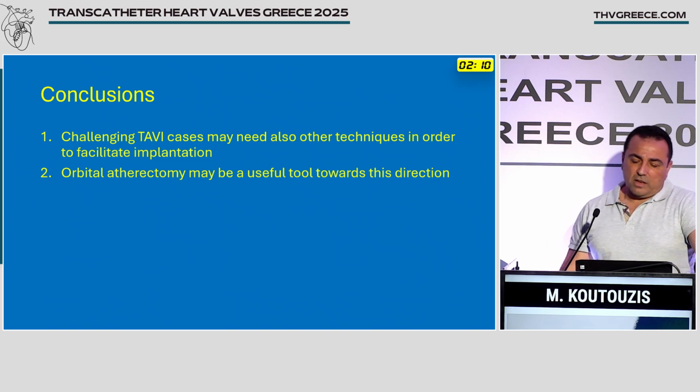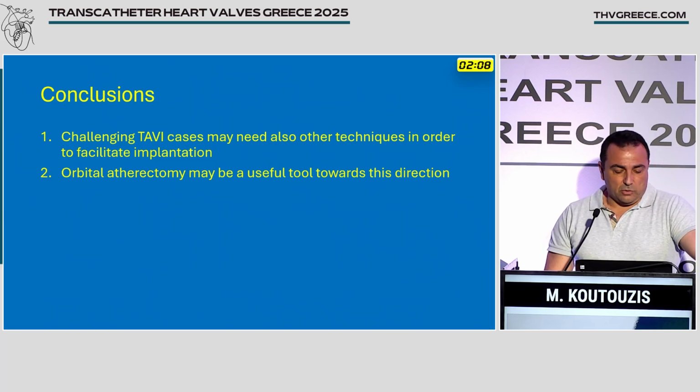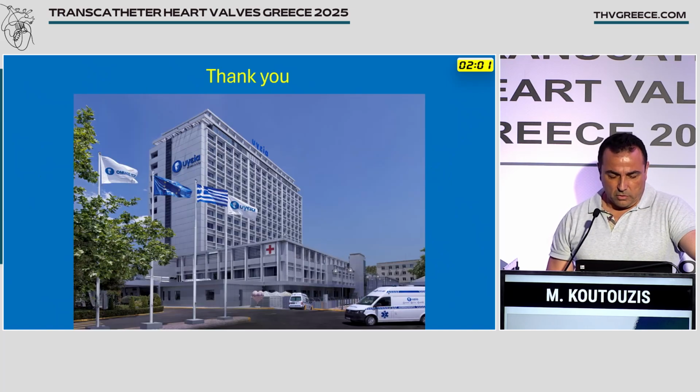So challenging TAVI cases may need other techniques in order to facilitate the implantation, and orbital atherectomy may be a useful tool towards this direction. Thank you very much.